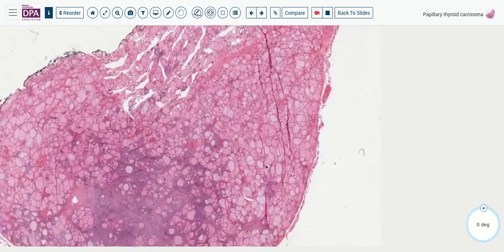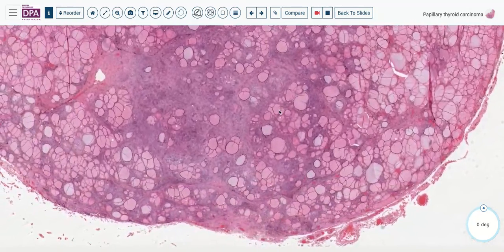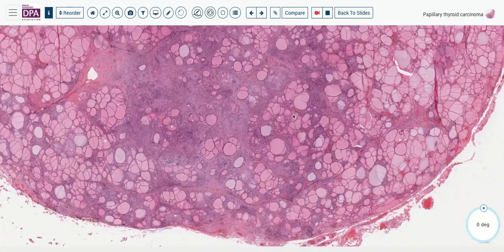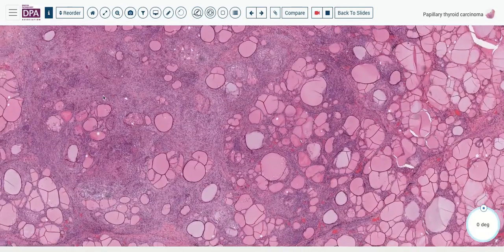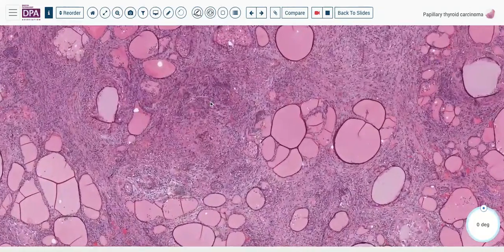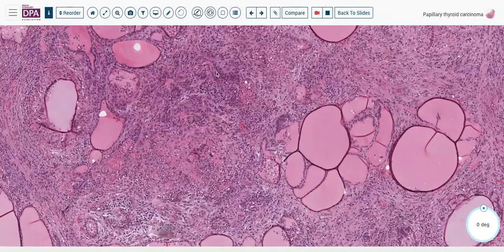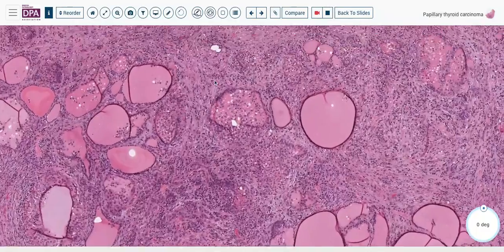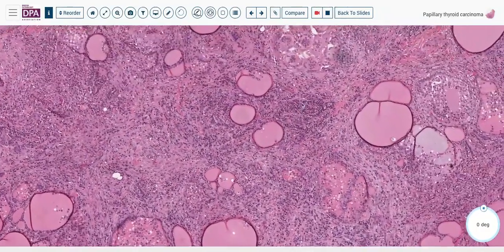Sometimes these tumors can be multifocal, and of course that has led to particular manifestations, or certainly surgical approaches. And many times these multiple foci are small foci in other lobes or other areas of the thyroid. And here's an example of such a lesion, a fairly small lesion. And this one looks a little bit almost granulomatous, very fibrotic here, as we see.